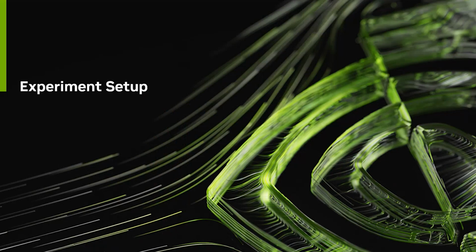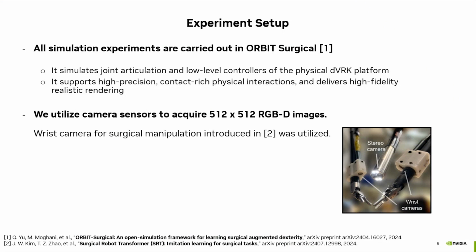So let's now talk a bit more about the experiment setup that we use for all the simulations and teleoperations. We use Orbit Surgical, which is the framework that was designed for surgical robotics, and is based on Isaac Lab. The great thing about Orbit Surgical is that it simulates the da Vinci Research Kit, or the dVRK. It models joint articulation and low-level controllers, and it allows us to replicate the physical behaviors of the dVRK.